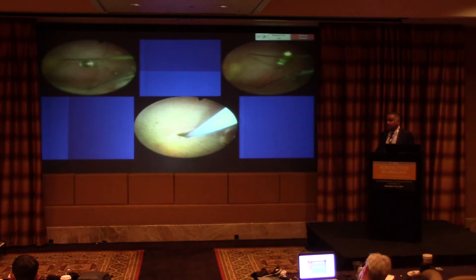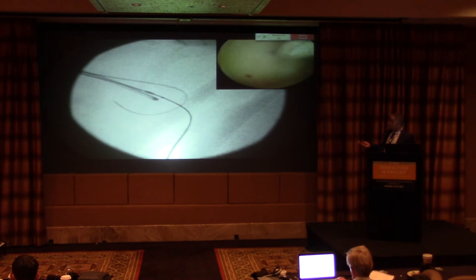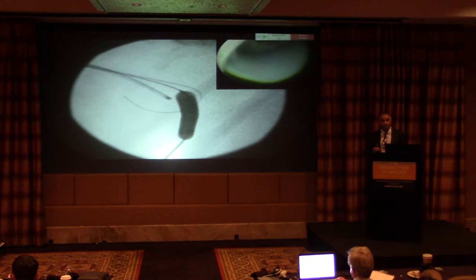The super stiff is important for dilation of the tract, but you notice here now there's only one wire. You don't need two wires because you have a hemostat on both ends, so this is now both your safety as well as your working wire. Tract dilation with a balloon, watching the sheath come in, everything done under vision as opposed to fluoroscopy. So we're decreasing fluoroscopy time and we're being more accurate.